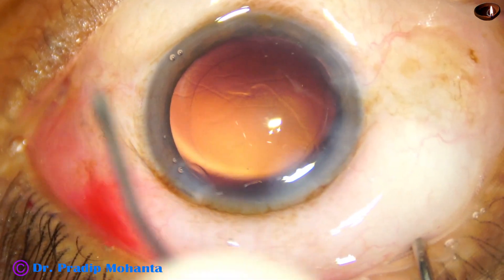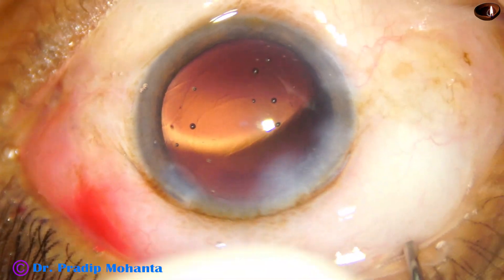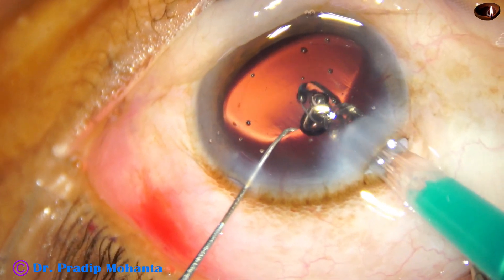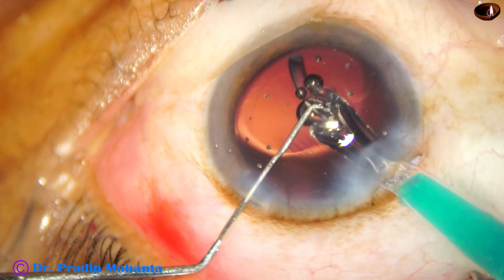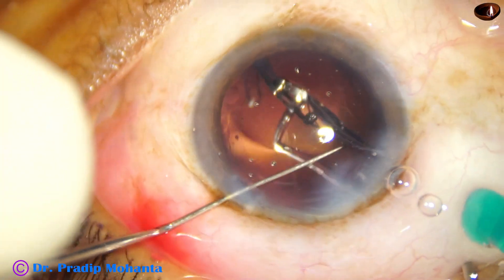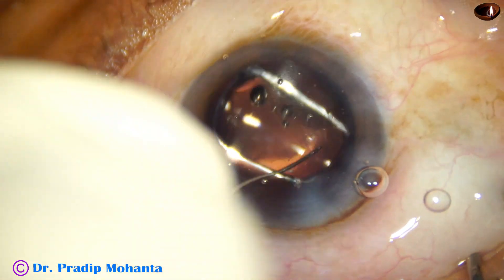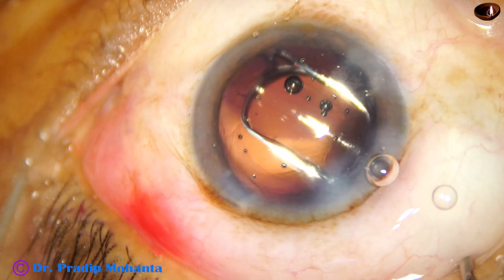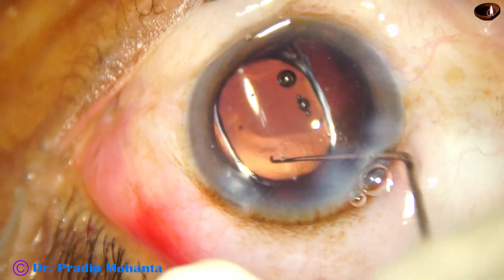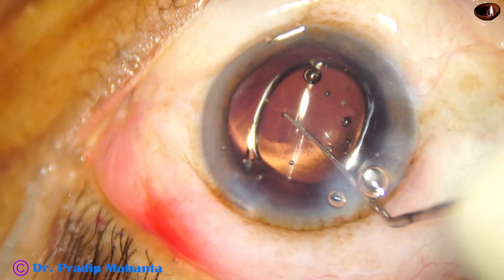Now don't try hydro-implantation — inject Visco and push the lens. The leading haptic should go into the capsular bag, and then the trailing haptic. If you can't place it this way, go through the right side port, dial the lens, gently push it backward towards the vitreous cavity, and it goes into the capsular bag.